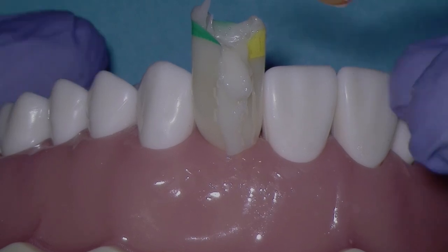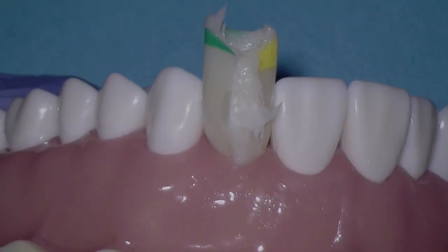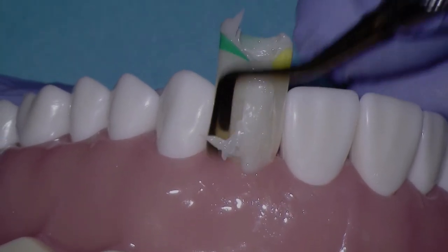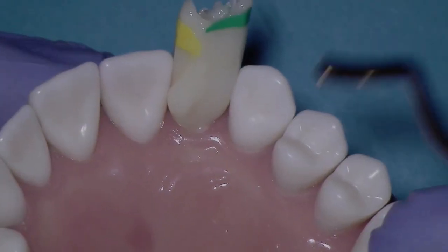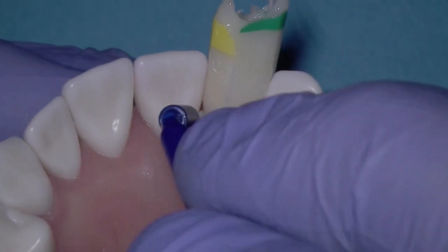Now, let's come in with a paddle and we'll quickly massage here on the facial and remove some of the excess. And also we need to massage the matrices because they've been expanded a little bit too much. So we massage gently on the matrices to get them back to their more natural position. Okay, let's remove excess here with the dry brush.